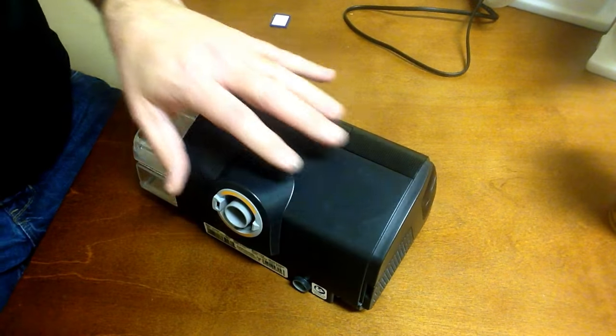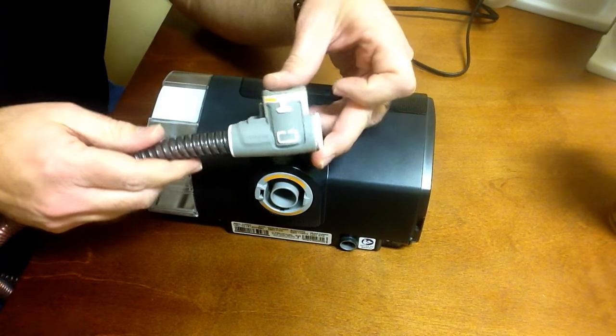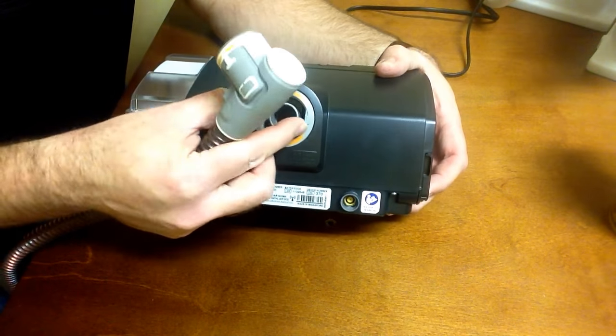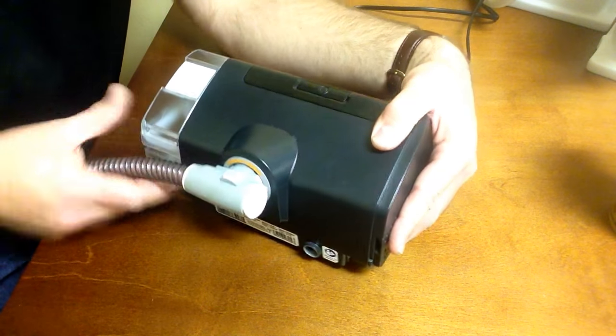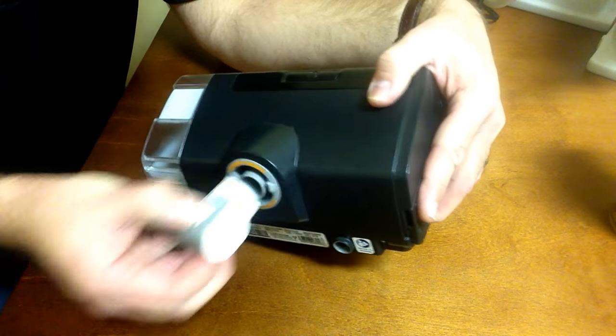With the heated tubing, it's a little bit different. The heated tubing for the AirSense 10 and AirCurve has an electrical connection, and you just need to line that up with the connection on the rear part, and it will click right into position. To remove it, simply press the two tabs on the hose.